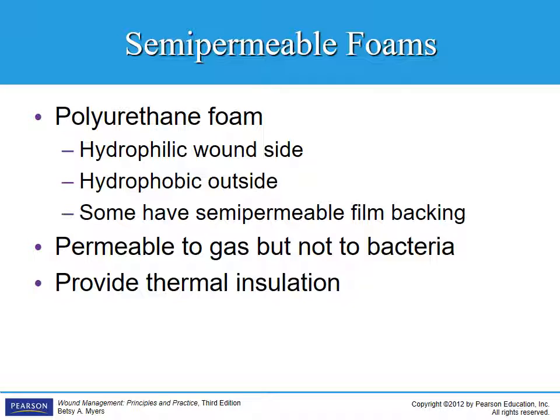So it's going to absorb any exudate on the wound side, but it's going to prevent any moisture from getting in on the outside. So it's hydrophobic. And some have a semi-permeable film backing, and that would be an example of a composite dressing, because you'd have a semi-permeable foam on the inside and a film backing on the outside of it.